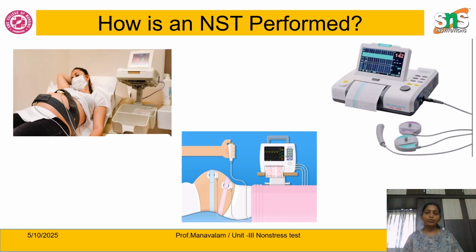So before putting the mother on the bed, we have to make sure that the mother has had food, and she must also have water with her, because it takes a short period of time. So the mother has to have water or any type of juice with her. Next, we have to make the mother empty her bladder.